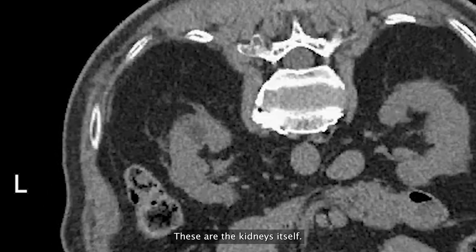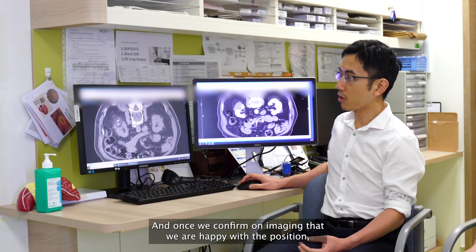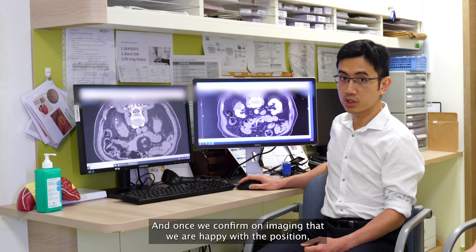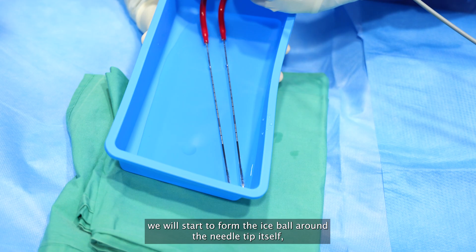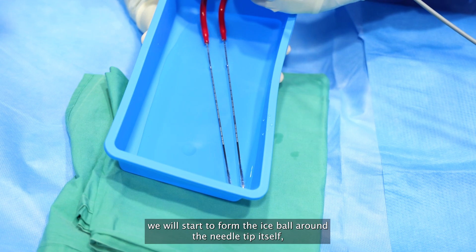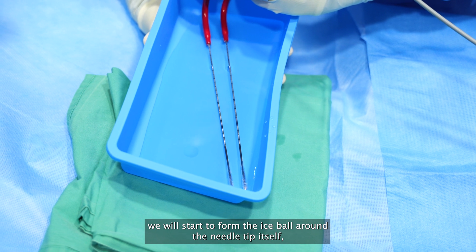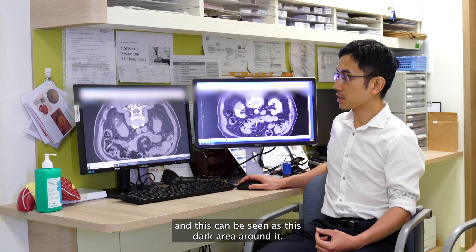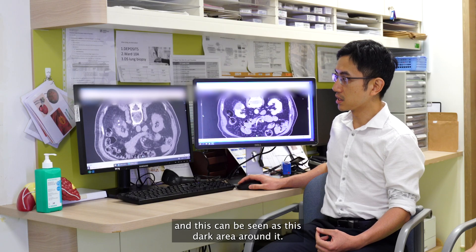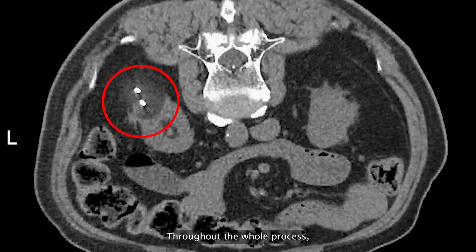These are the kidneys themselves. And once we confirm on imaging that we are happy with the position, we will start to form the ice ball around the needle tip itself. This can be seen as the dark area around it.